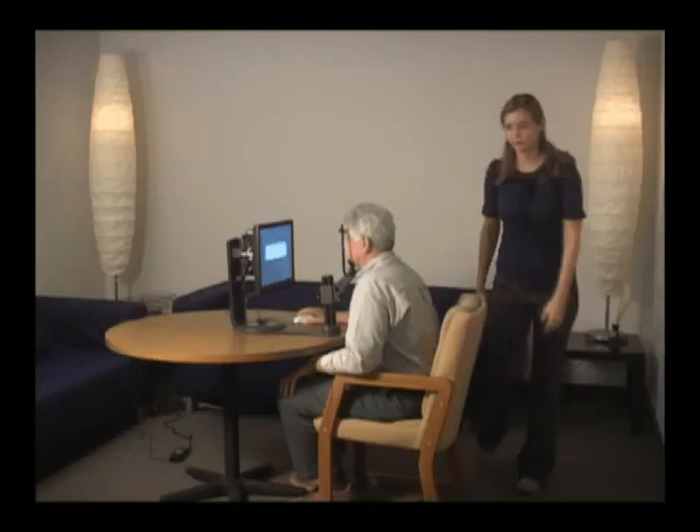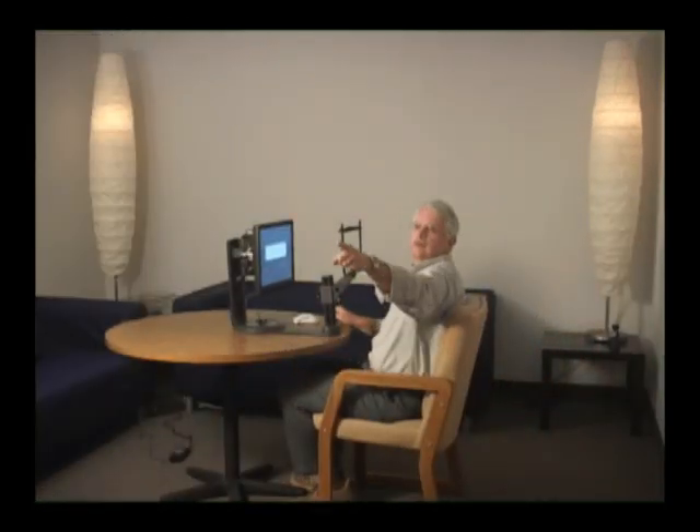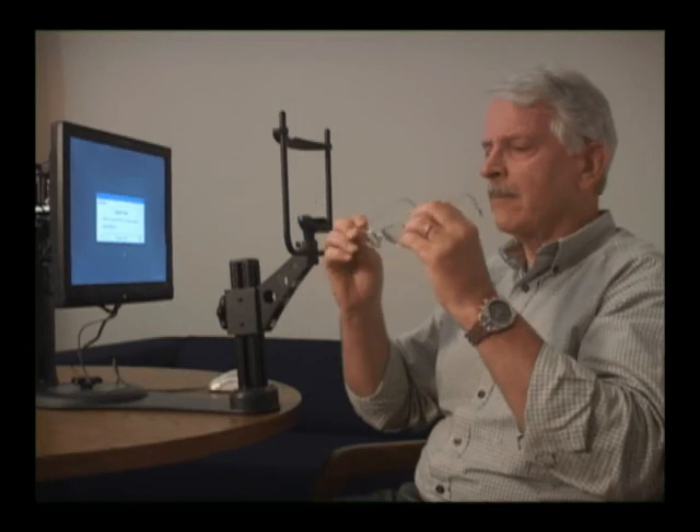A dimly lit room is important for performing VRT — about as dark as a movie theater would be perfect. Because you'll be performing VRT therapy on a display that is at about reading distance, it's important that you use whatever reading glasses you traditionally like to wear for reading printed material. We want you to see the screen as clearly as possible. Of course, if you read well with no glasses, then doing therapy that way should be fine too.